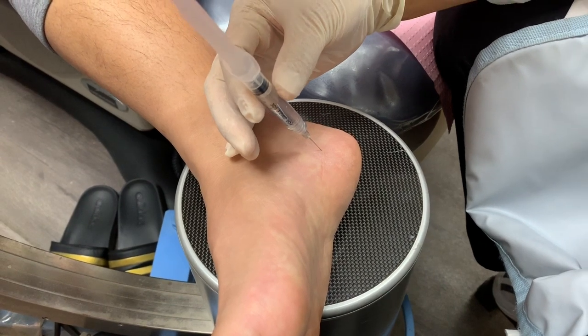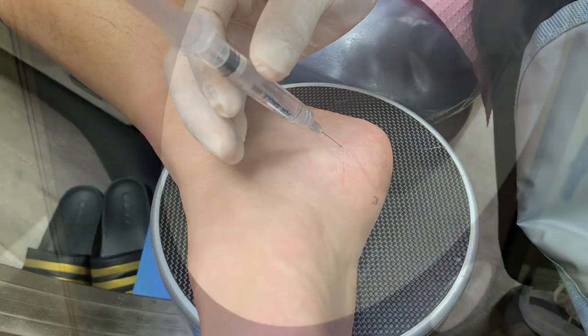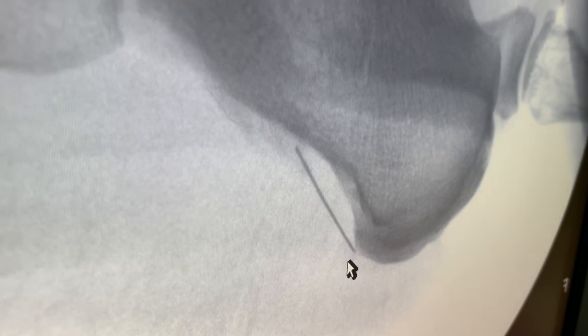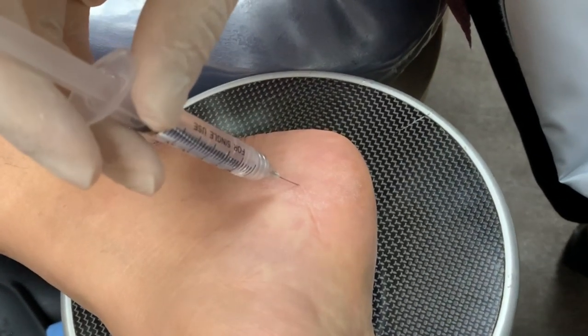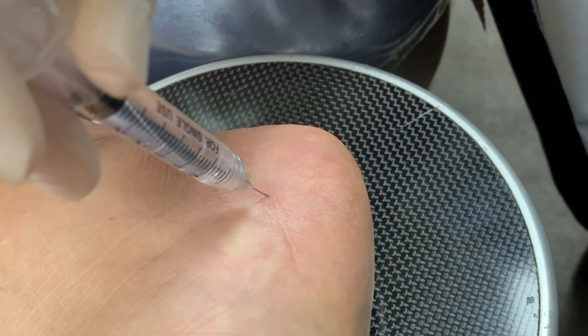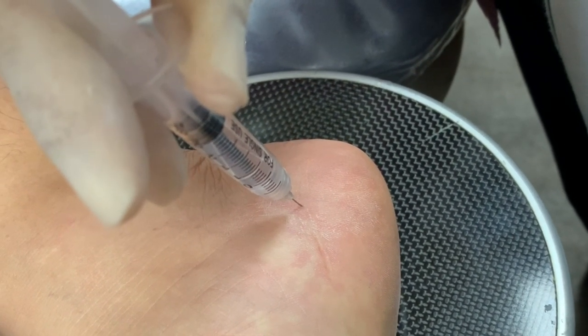So I locate it with the machine exactly where that spot is and then I start injecting — right at the bottom of that heel bone, right where I need to be injecting. With this live x-ray machine I can exactly locate what I need to inject, which is really important because if I put it in the wrong area it won't be very effective. I'm going deeper and then I inject right at the insertion site of the tendon into the bottom of the heel bone.